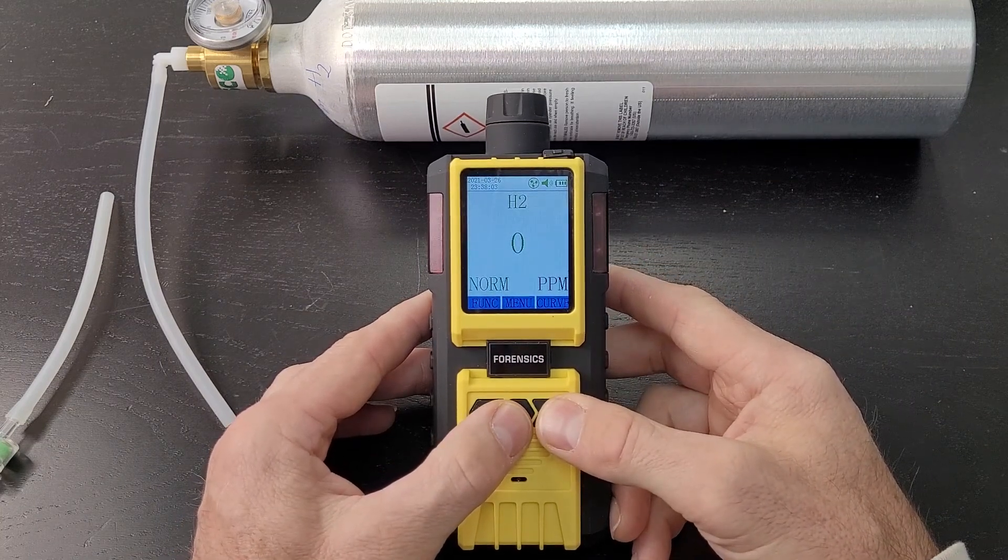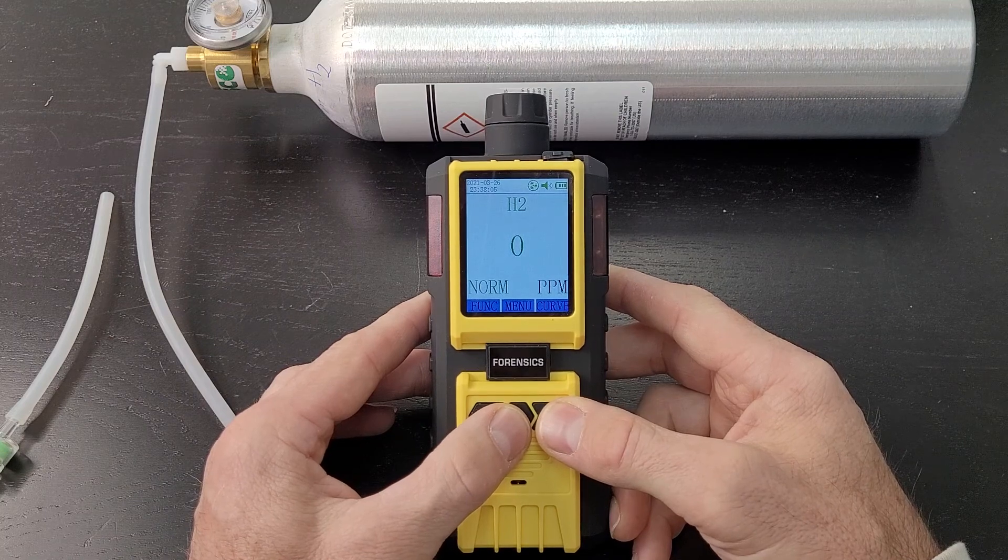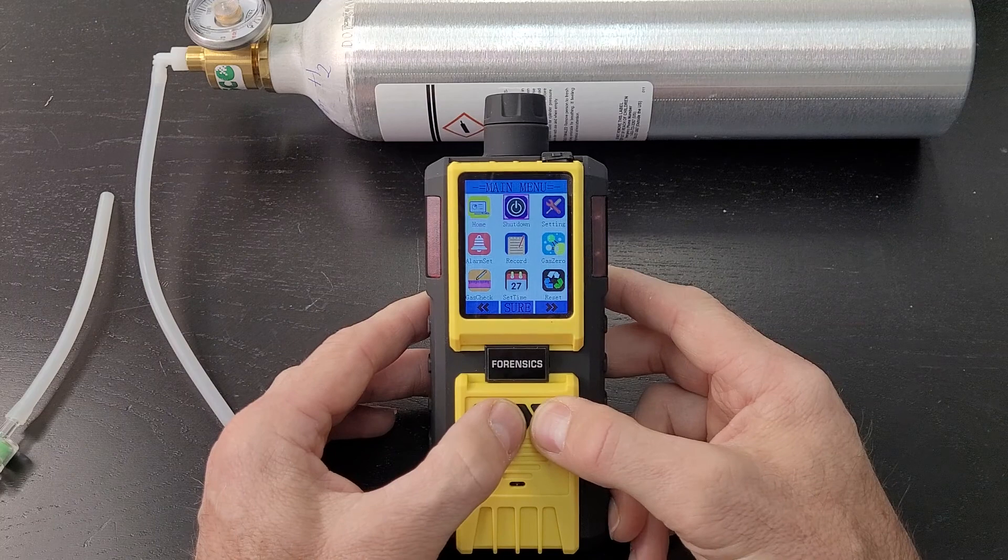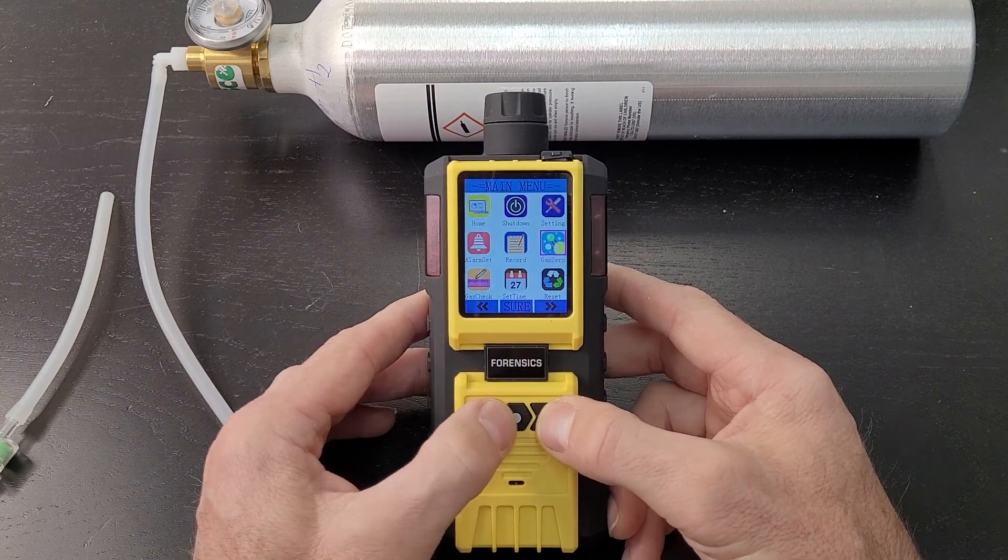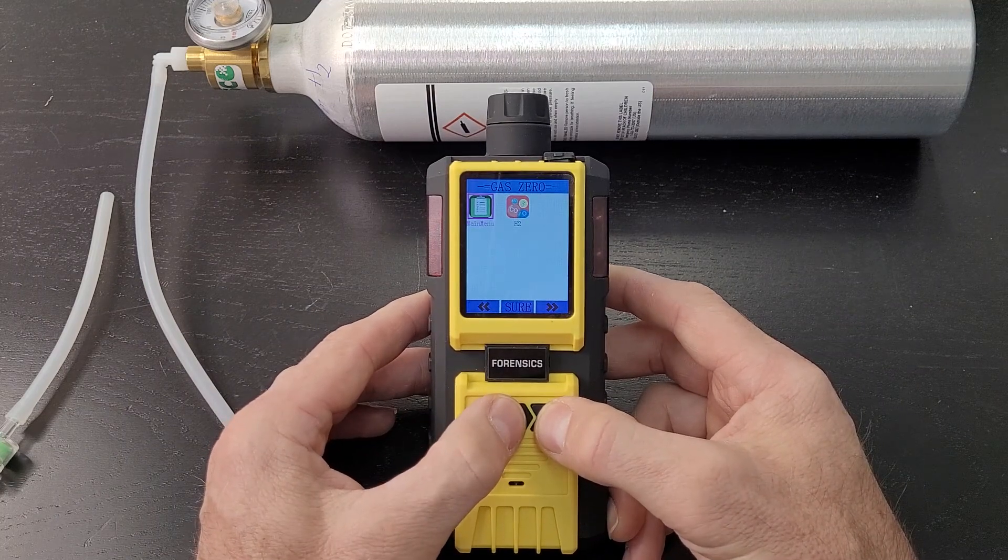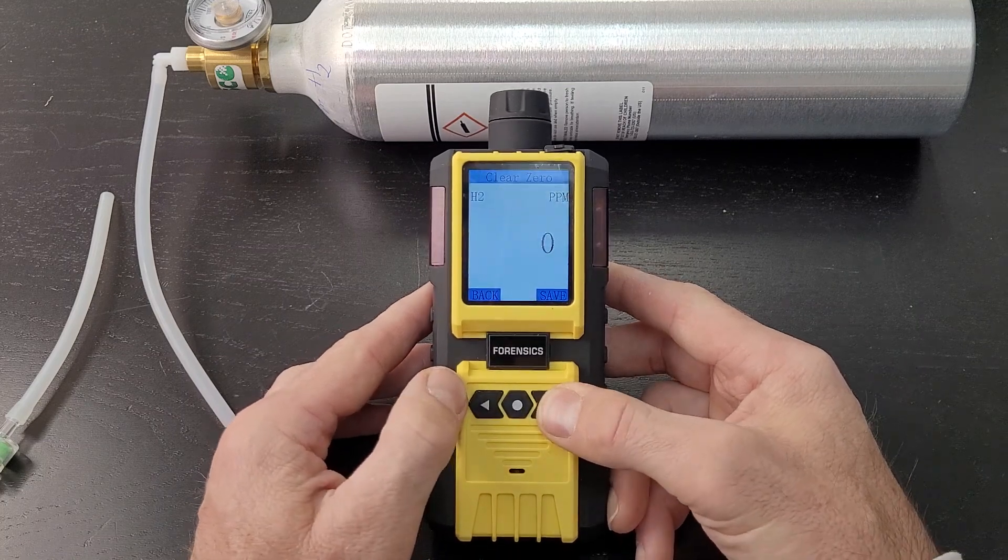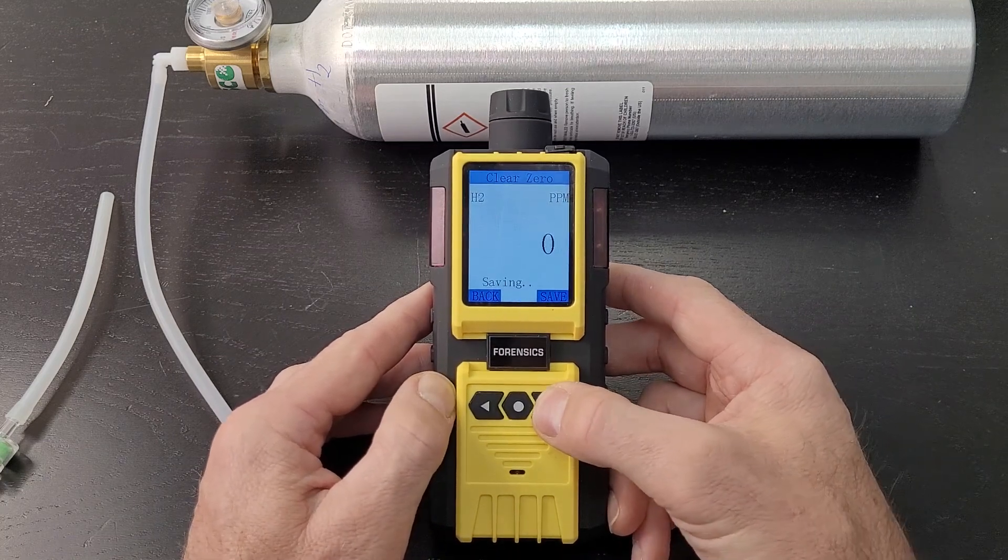Make sure it's fresh air. If you're not sure, just take it outside in the fresh ambient environment. Go to menu, click through, go to gas zero, click H2. We're selecting the sensor that's in the meter. Click save - you've done it, easy as that.